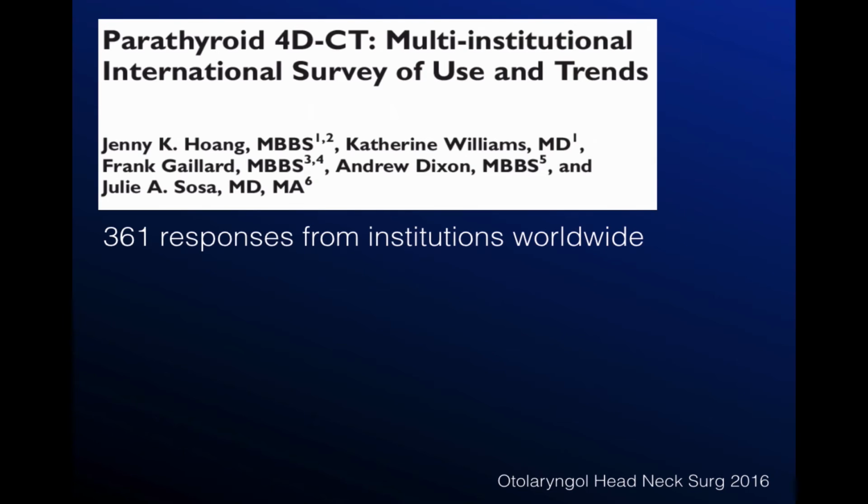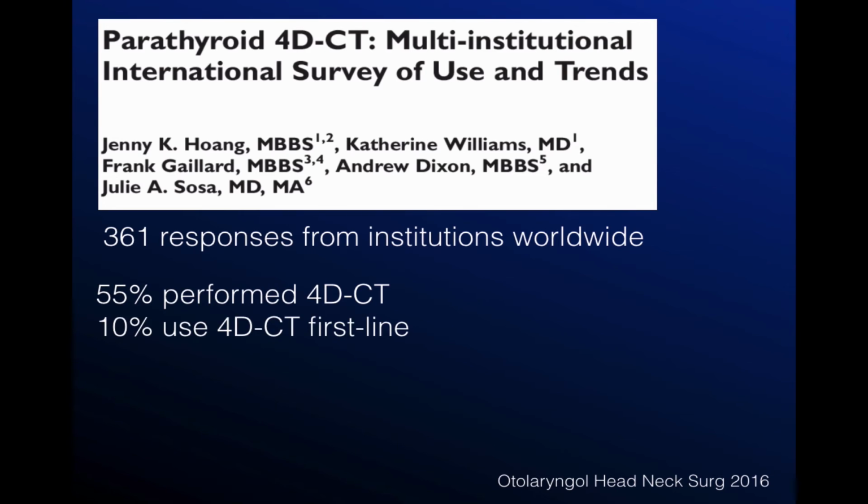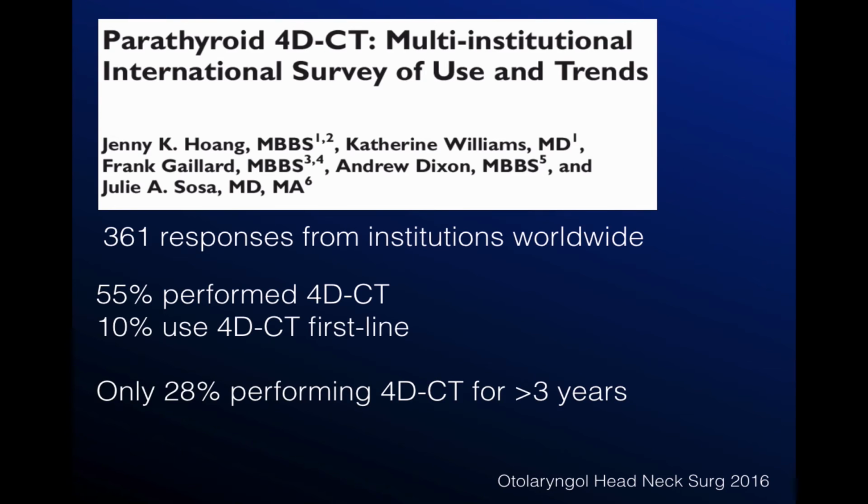Finally, what do the masses say? What do other people do? We surveyed more than 360 institutions worldwide, and the results are interesting. More than half of the radiologists performed 4D-CT, but only 10% used it as a first-line study in their practice. However, only 28% of the practices have been doing 4D-CT for more than 3 years.